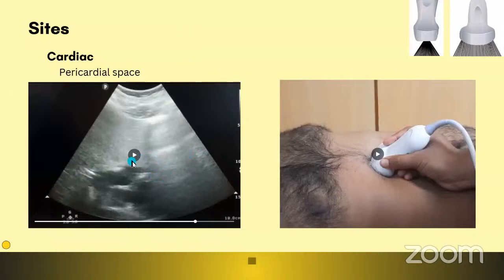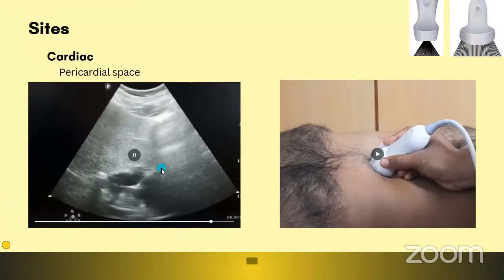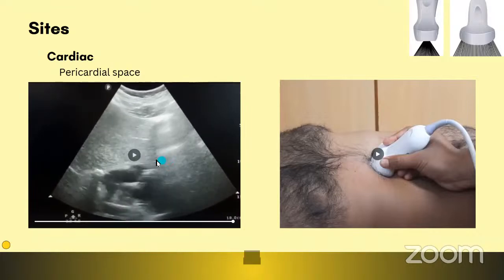However, ultrasound is more real time, and at least for me, it is more enjoyable, as you are able to appreciate all the intricate details of the organs in real time in the form of a video. Then you can freeze it later to analyze or measure, etc.